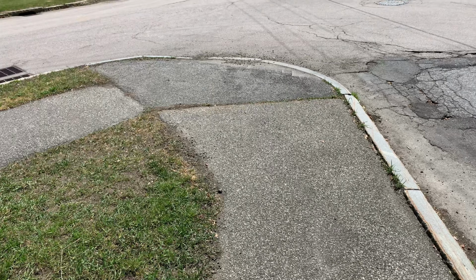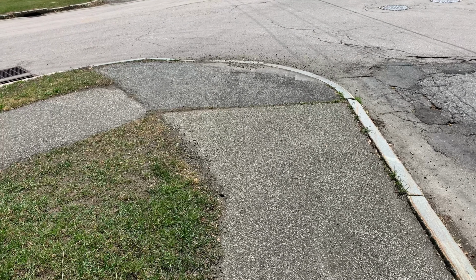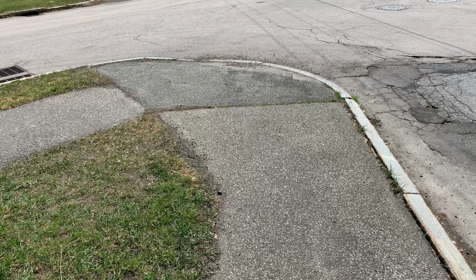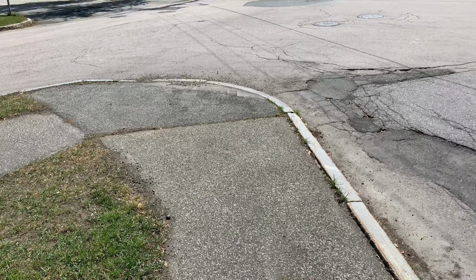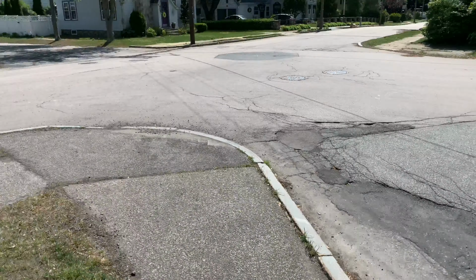So for my second corner demonstration, I want to demonstrate what it looks like locating a corner on a blended corner that blends into the street. So in front of me here, I am along still again a residential sidewalk, and in front of me is a corner that blends into the street. And there's a few different cues I can use to help me locate this corner. One is the sound of traffic, but right now there's not much traffic going on, so it's quiet, so I wouldn't recommend using that at this point.